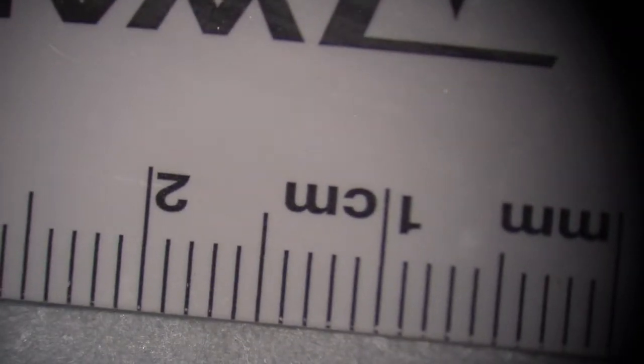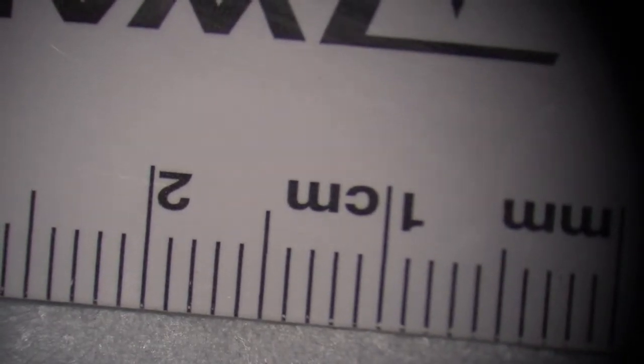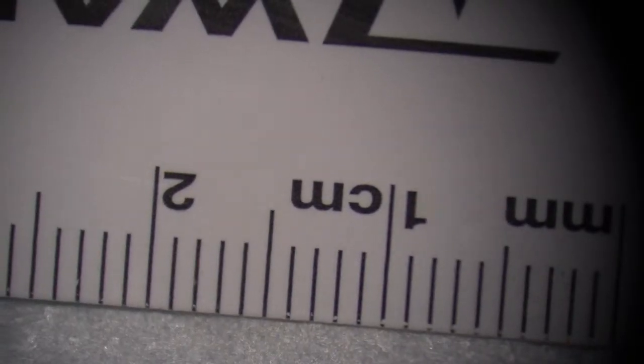Now you can see clearly. Now you step on the focus and adjust a little bit. Here's more focus. You can step and try. No matter, mess it up. I want you to mess up and make it clear again. That's the learning process. Now it's perfect.